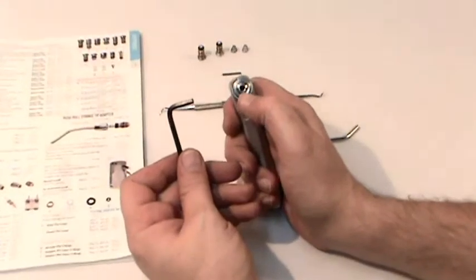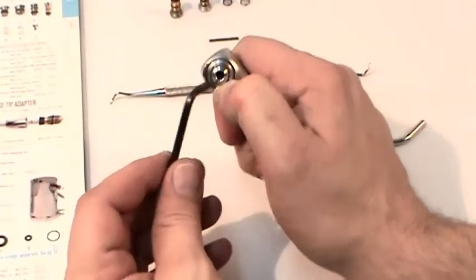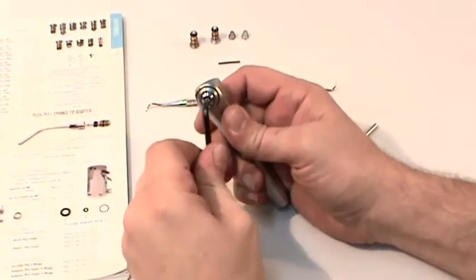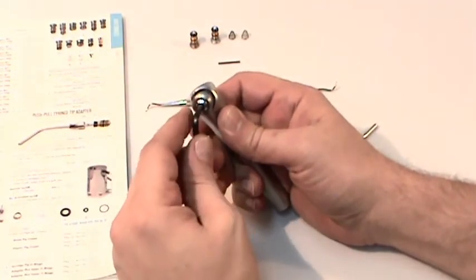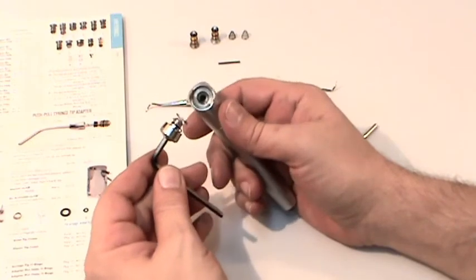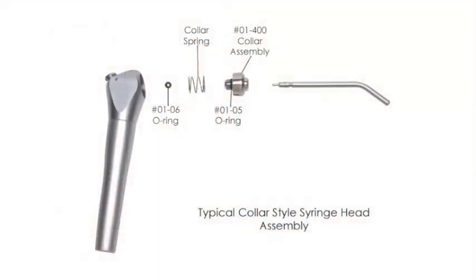On the DCI, or collar, syringe, the collar assembly is removed by inserting the Allen wrench into the tip hole and turning counter-clockwise. There is an O-ring on the threaded portion of the collar assembly, and one that fits into the head of the syringe, as seen here.